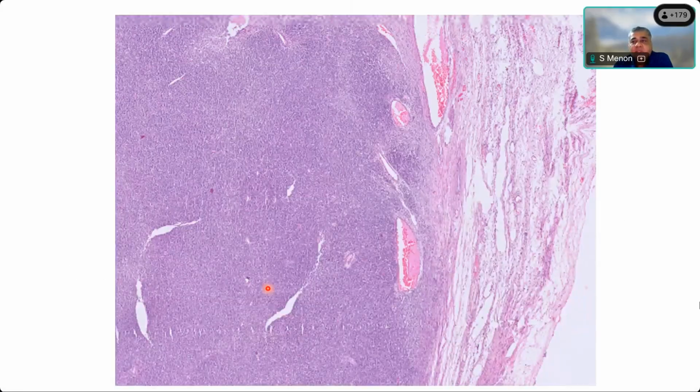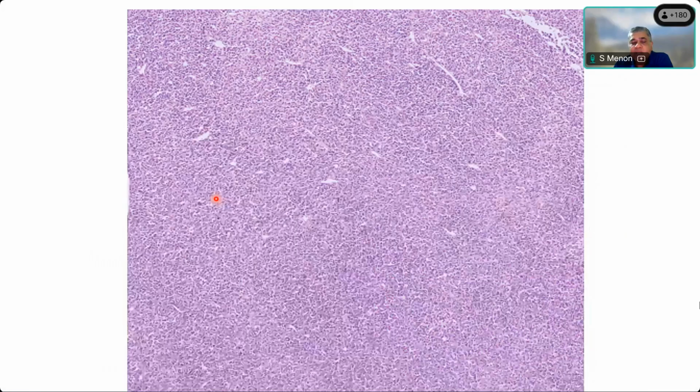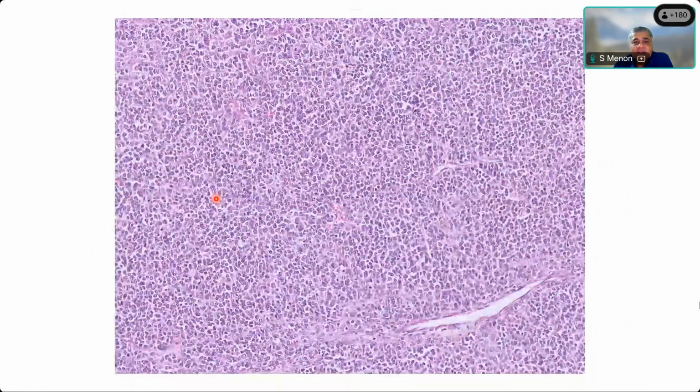So this is your tumor. It looks very blue at this low power. It's a little hazy, sorry for that. Here you can see it's a very nicely blue-looking tumor. You can see the ovarian capsule is very intact, at least in this section. Intraoperatively it got ruptured, but at least in this section it is very well preserved. Again, a very monomorphic looking tumor at this power. And this is a better picture to show you a very monomorphic looking tumor.